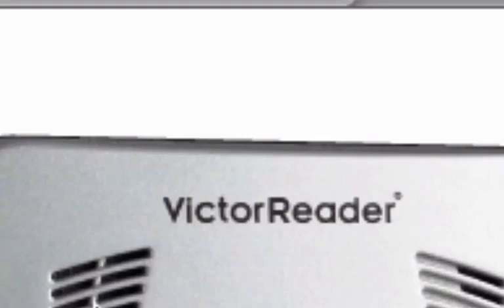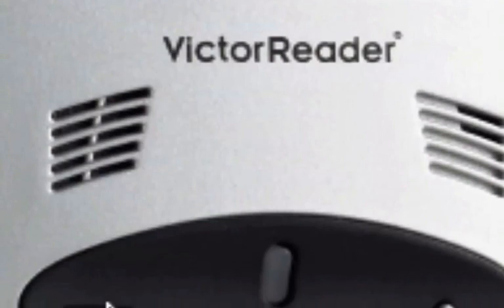Then there's this. This is the Victor Reader Stream. If you want to take a look at JLS1114's video on the stream, she has a very good example of this, and I have a similar product called the FlexTalk Pocket. One thing that this comes with that the Pocket does not is a piece of software that, for those of us who are not nearly as computer literate as others, they can use to more accurately and more conveniently organize their books, and it's like a drag-and-drop process, kind of like iTunes with the iPod.